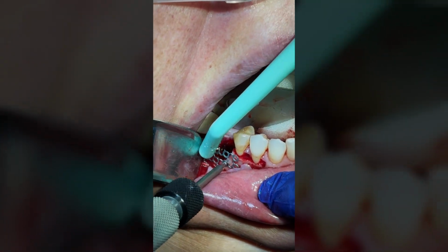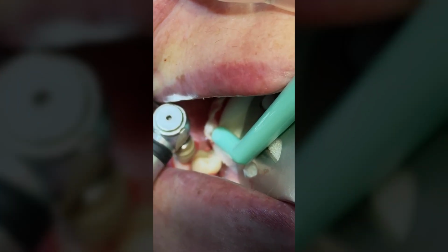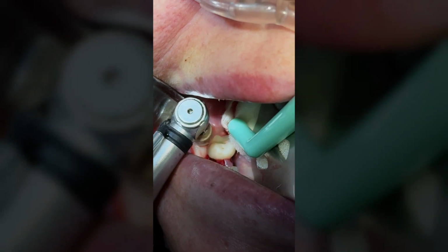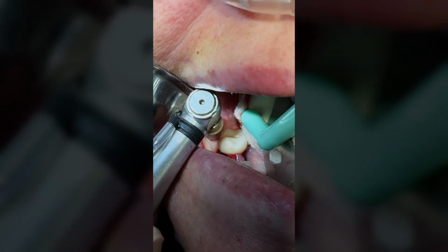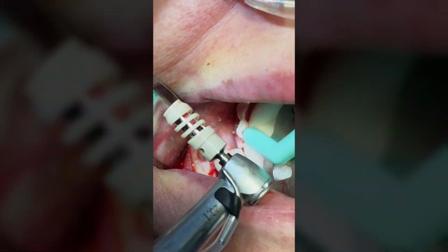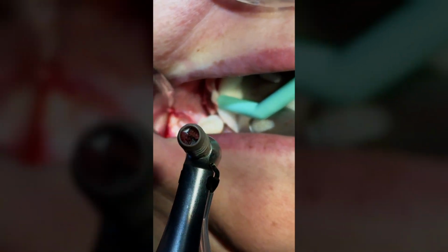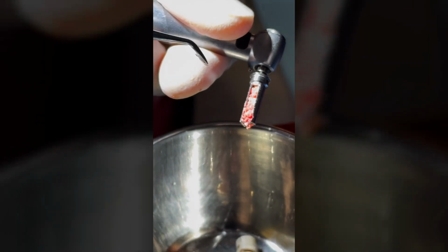You can see this. We use the Autogen Chip Maker, ACM, from Neobiotech. This chip maker comes in different depths and sizes. We go to the retromolar area, just distal to implant number 31, and we sink it in, and then we harvest the autogenous bone. This is the autogenous bone coming in.